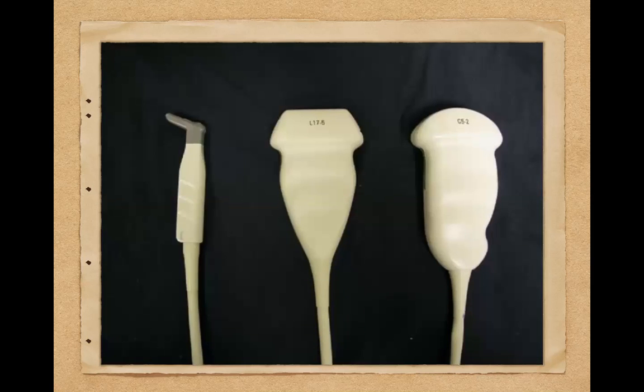And those are the different probes we use: our hockey puck, our linear array, and our curvilinear array.